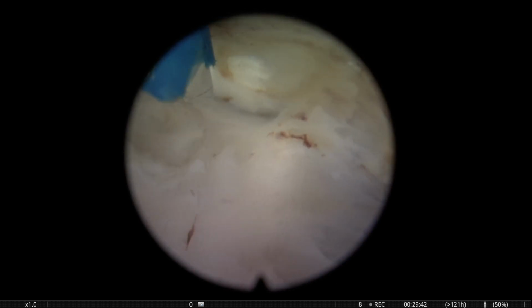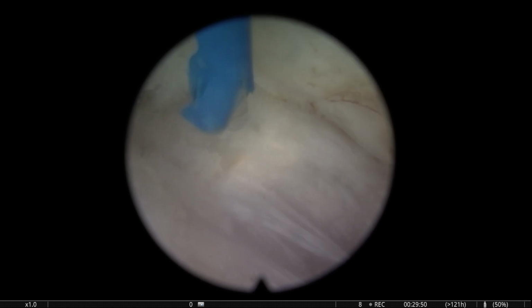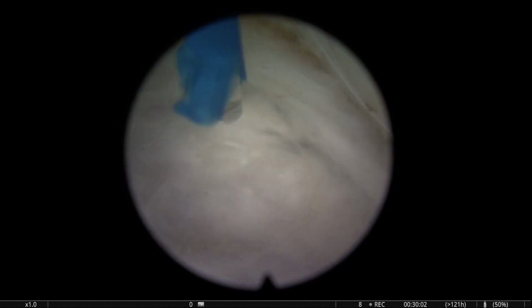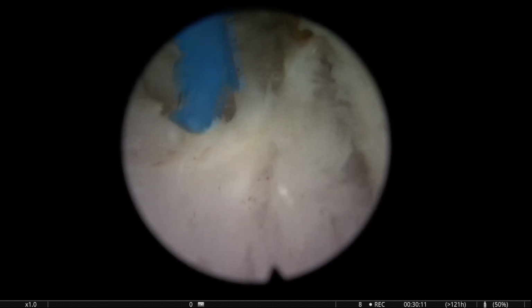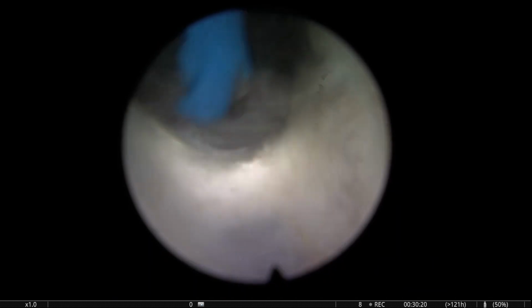Of course, the fossa is now very distended because of the pressure. The moment we put a catheter, all of this is going to collapse, and I think all these fibers and things are going to stick together, and there will be an inflammatory process, clot formation, all these things that will allow the capsule to heal very fast. Usually we remove the catheter the next morning, except if there is a very deep undermining of the trigone, which is not very usual. Sometimes it may happen, and then we might decide to keep the catheter for a couple of days rather than just one day. And that's reaching an end.